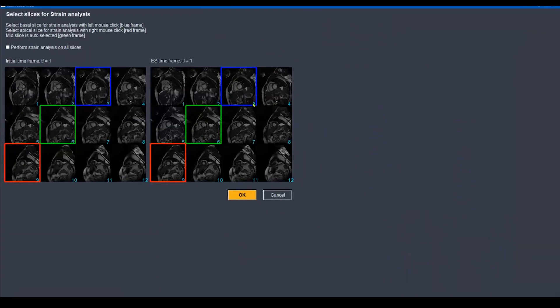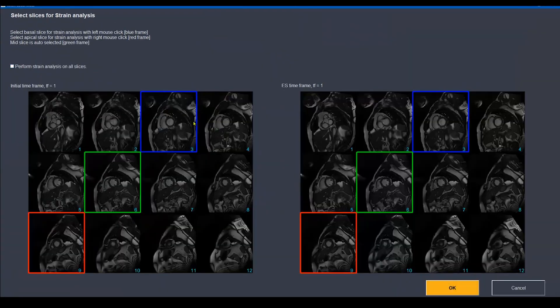It will open this window which contains the short axis slices from base to apex at the initial time frame and supposedly the end systolic frame. But they are the same because we didn't set the end systolic time as the correct end systolic time frame.